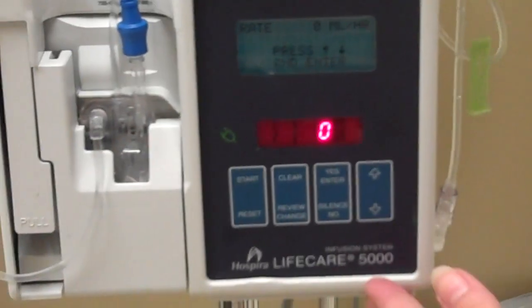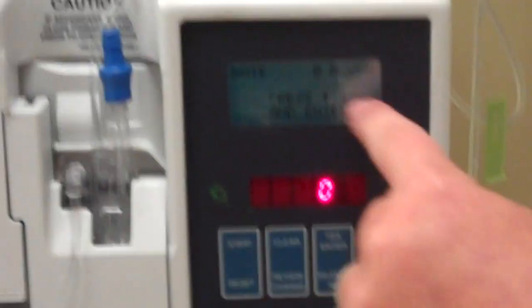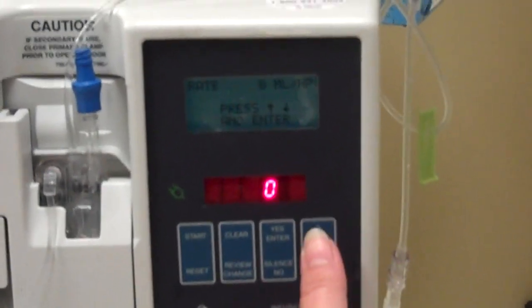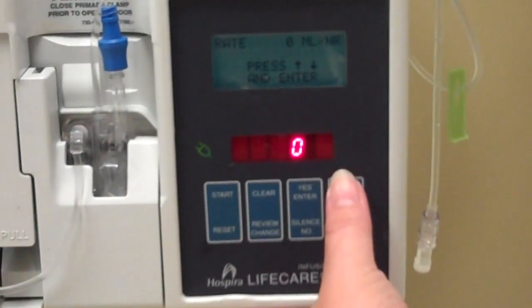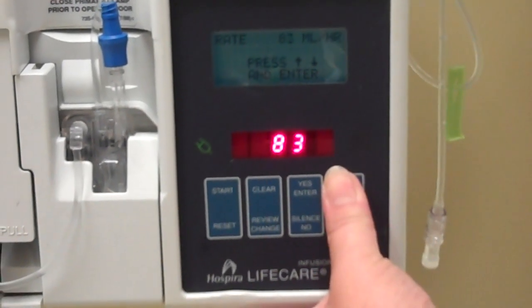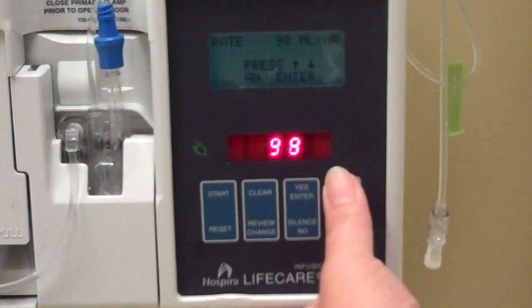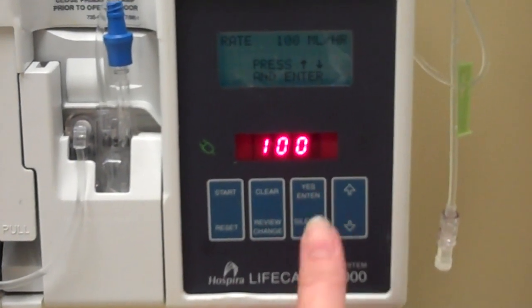It's asking for the rate — the rate of the primary. It tells you exactly what to do if you follow the directions. It says press up or down and enter. After checking your orders, I'm going to press up. We'll put it at 100 cc an hour, so I'm going to go up to 100. It will move fast, it will move slow — don't worry if you go over. 100, and then enter.